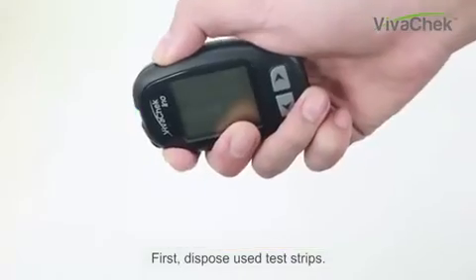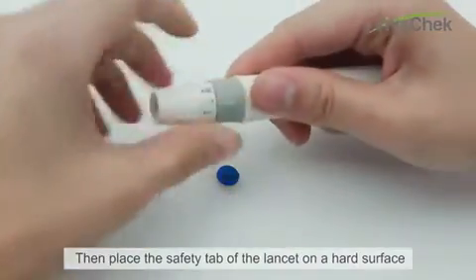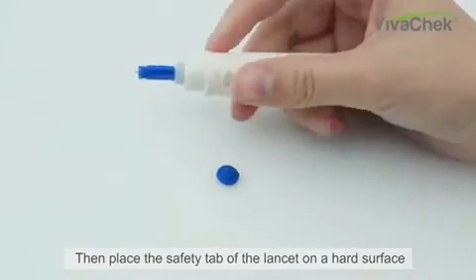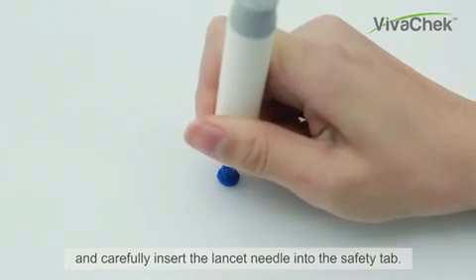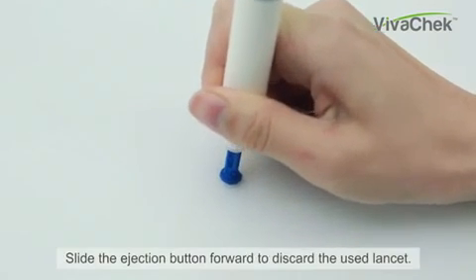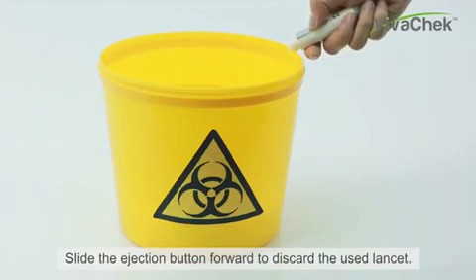First, dispose of the used test strip. Then place the safety tab of the lenset on a hard surface and carefully insert the lenset needle into the safety tab. Slide the ejection button forward to discard the used lenset.